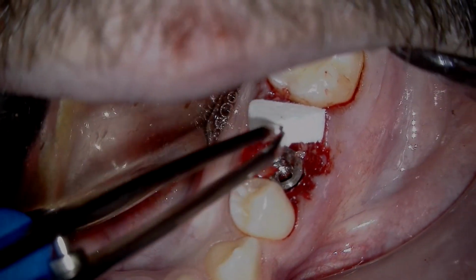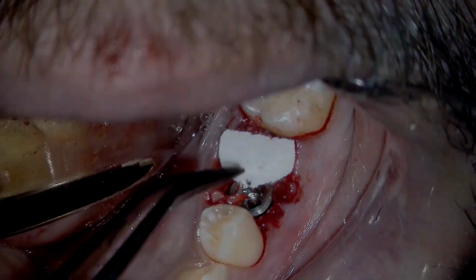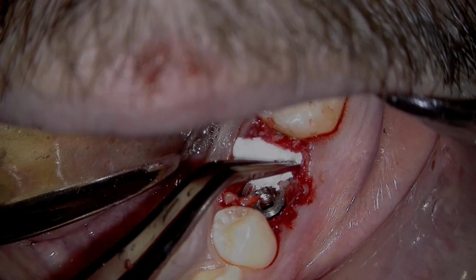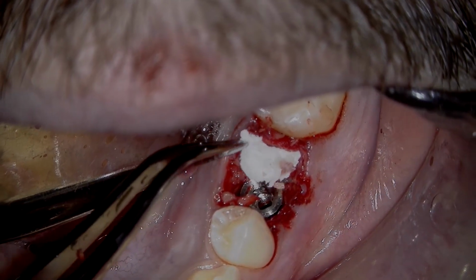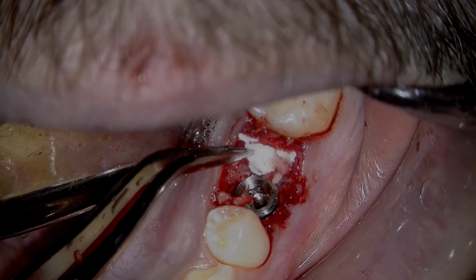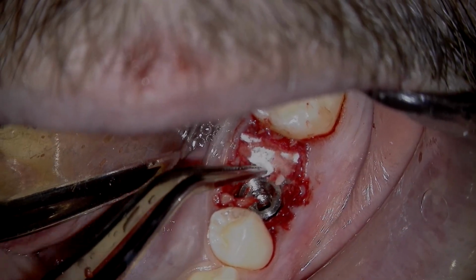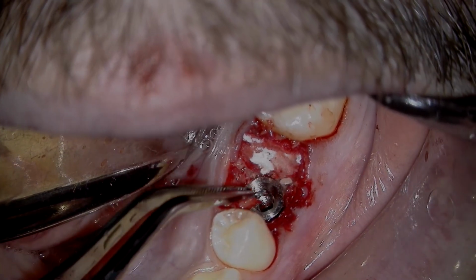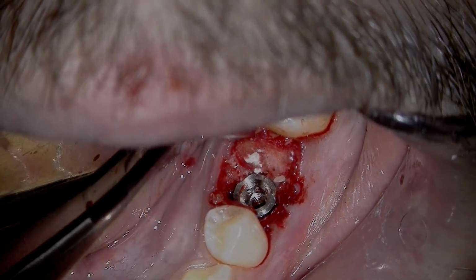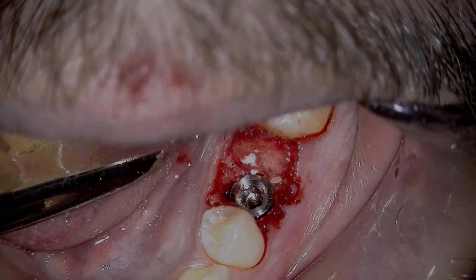I've also chosen to place a resorbable membrane over the top of this graft. And I'm going to let the blood kind of wick it into place as I tuck it down underneath the gum tissue. And just watch the saturation as it wicks in the blood. And this is forming a clot. So the secret is not to over manipulate it. You just kind of let the body do its thing.